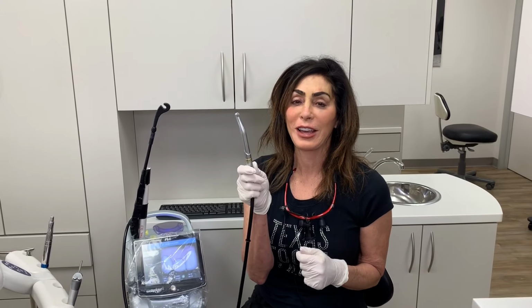Today we got a laser case. We're going to recontour the gum tissue of one front tooth to make it look symmetrical to the tooth next to it. Have you ever had a tooth where the gum is lower on one tooth than it is on the other? Well, we're going to correct that because that's going to create the symmetry that you need to have an even looking smile. So let's go ahead and take a look at our patient.